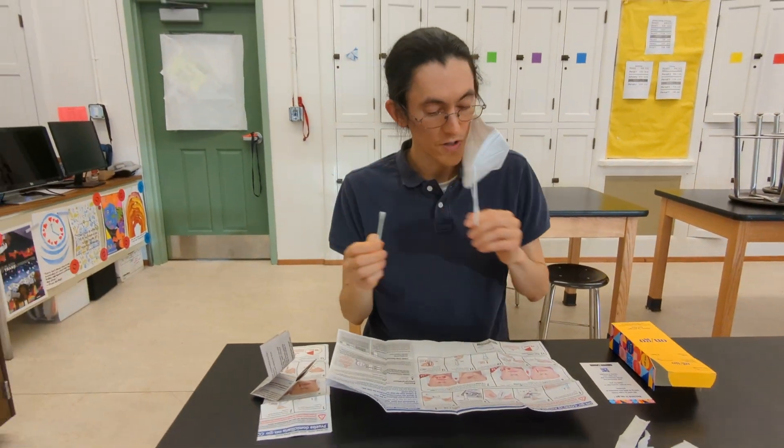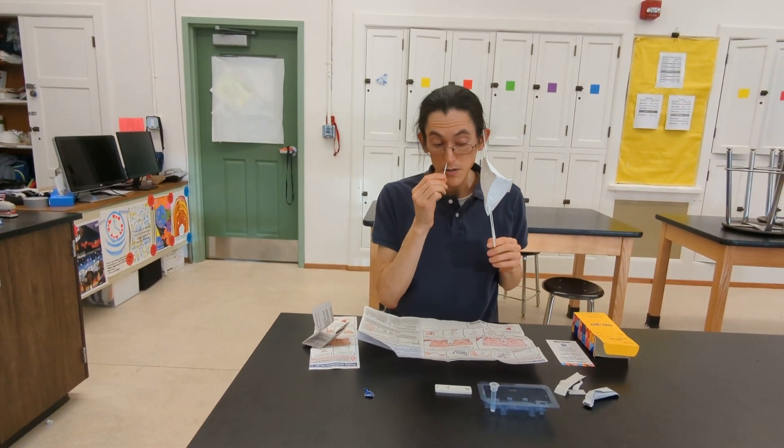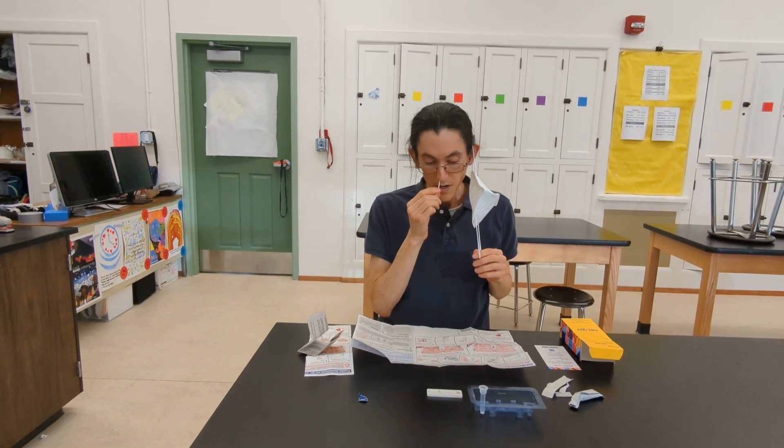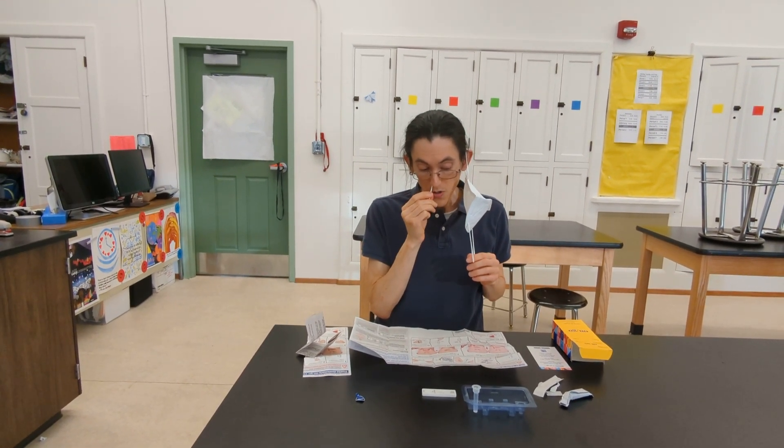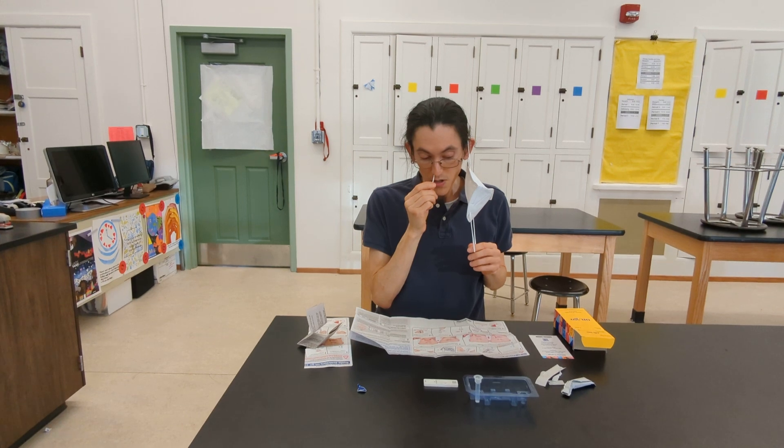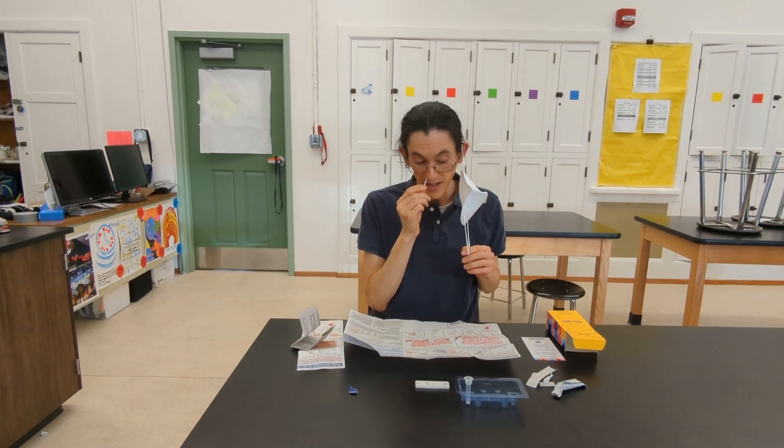You're going to gently insert the swab into your nostril, about three quarters of an inch, and you're going to slowly rotate around five times in a circular pattern for a total of 15 seconds.